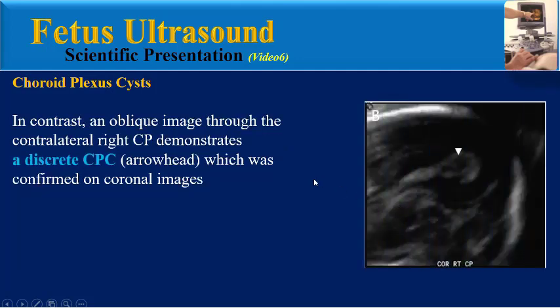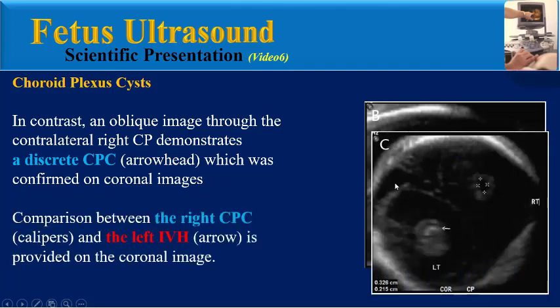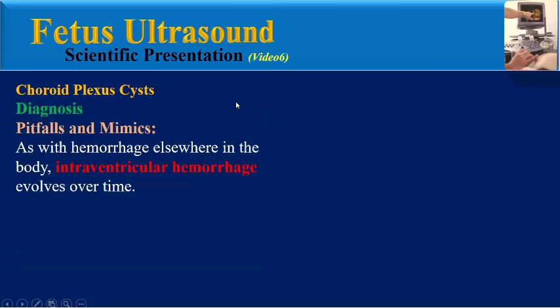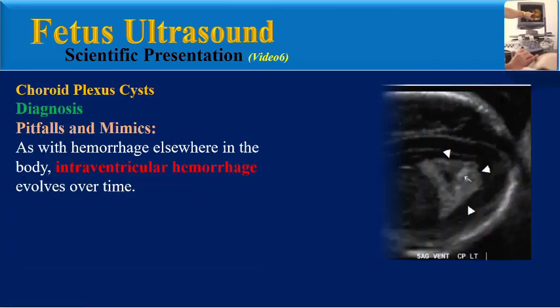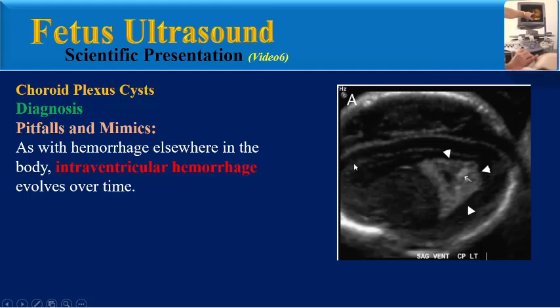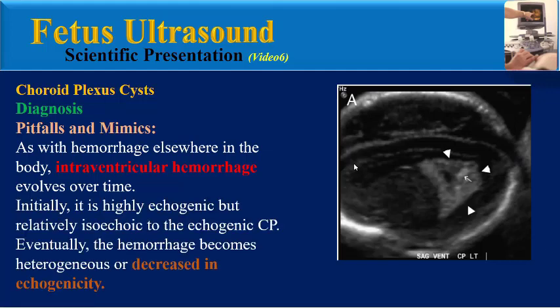In contrast, an oblique image through the contralateral right choroid plexus demonstrates a discrete cyst, confirmed on coronal image. In this coronal image, we can compare the right choroid plexus and the left intraventricular hemorrhage. As with hemorrhage elsewhere in the body, intraventricular hemorrhage evolves over time. Initially it is highly echogenic but relatively isoechoic to the echogenic choroid plexus. Eventually the hemorrhage becomes heterogeneous or decreased in echogenicity.